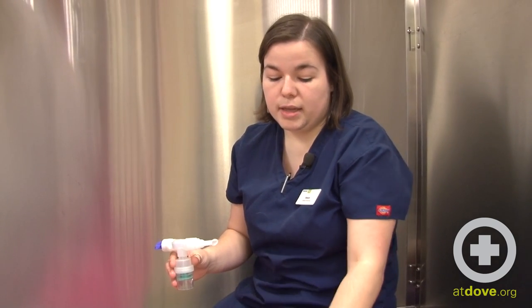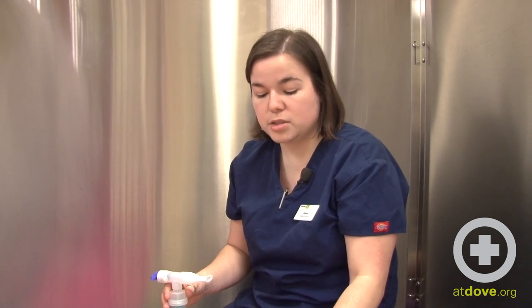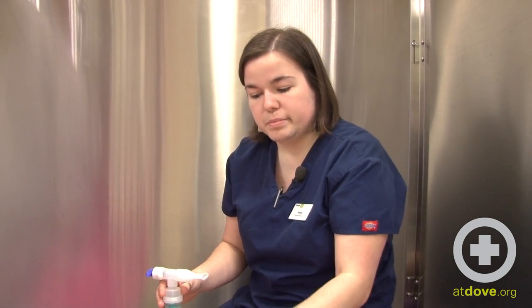Once the air runs through the saline it's going to come out the nozzle in a fine mist. He'll inhale that and it will thin out the secretions in his lungs and make it more likely for him to be able to get those out. The nebulization is just the first part. Once those secretions are thinned out, then we perform coupage, which is a firm percussion on his chest to help loosen up those secretions and help him cough those out.